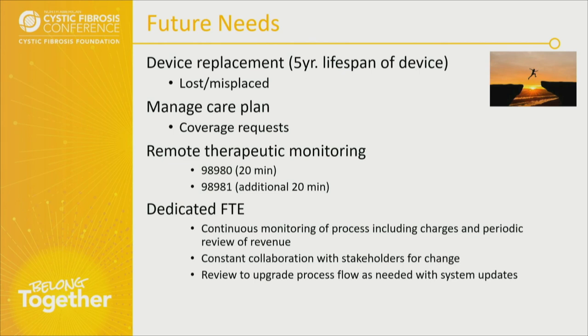I did contact Zephyr to find out what's the plan because the foundation set up a bundle program for the CF community. So presently, if you were a new service line and wanted to get a device, you would be paying $145, but it would not be a subscription to the dashboard. The CF Foundation created a bundle contract with Zephyr Rx and purchased whatever was needed per care center, but got it for $145 that included the dashboard. So if you started today without getting the subscription initially with the dispensing, you will now need to pay for the dashboard. So this is important, and make sure you clarify that when you reach out to Zephyr Rx if you have not initiated and have not yet dispensed devices.